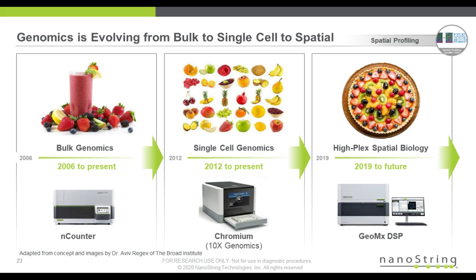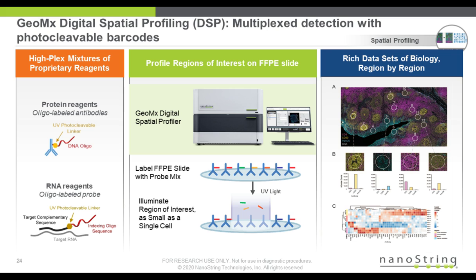You know, the regrettable thing is you do all this single-cell work, and in the end, you need to know how those cells are organized in a spatially resolved manner, because these single cells don't actually do all the work. It's actually the tissues themselves that do all the work. And that was the emphasis behind developing this high-plex spatial biology technology called GeoMx.